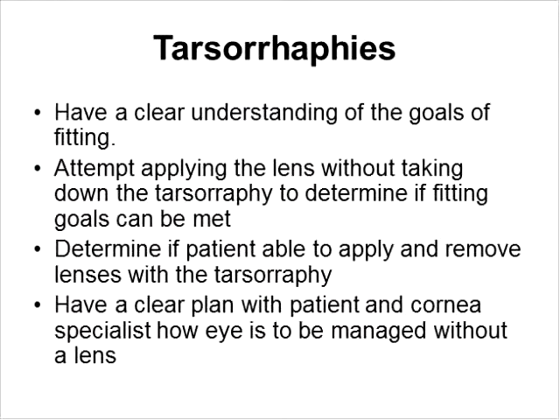And it's very important to have a clear understanding of what the goals are that you're trying to achieve for fitting. Is it to support the surface? You want to discuss with the cornea specialist who's referring how to manage this patient and actually have a clear understanding of if the tarsorrhaphy is to be taken down and when the patient is to first be fit. You don't want to delay the fitting from the time of the tarsorrhaphy being taken down, because if they're prone to epithelial defects, they will break down.